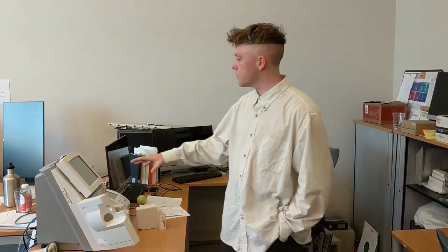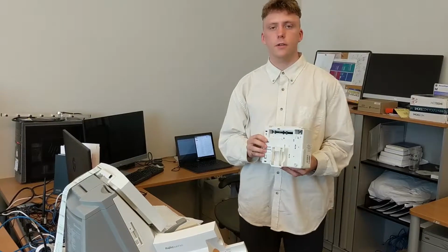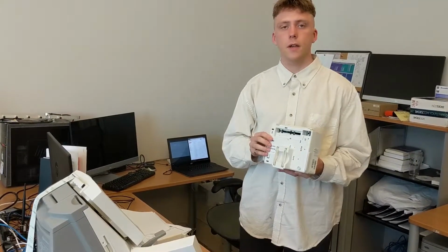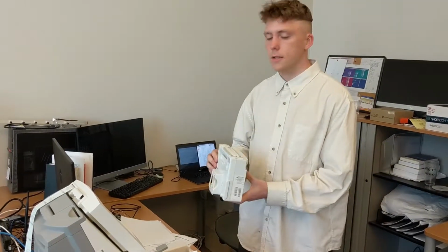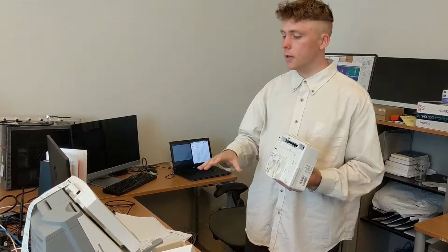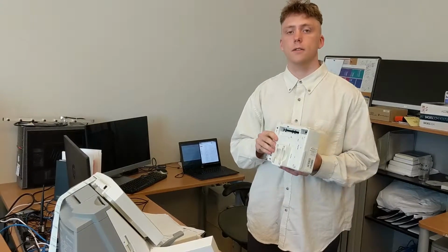Today we're going to be looking at reverse engineering the measurement cartridge for a typical hospital blood gas machine, such that the measurement cartridge won't expire and you can get infinite health cartridges. So these cartridges are typically single use with a 28-day countdown timer. That means that once you put it into the machine, you can't take it out without invalidating the cartridge. Additionally, if 28 days go by, the cartridge will be considered invalid as well.